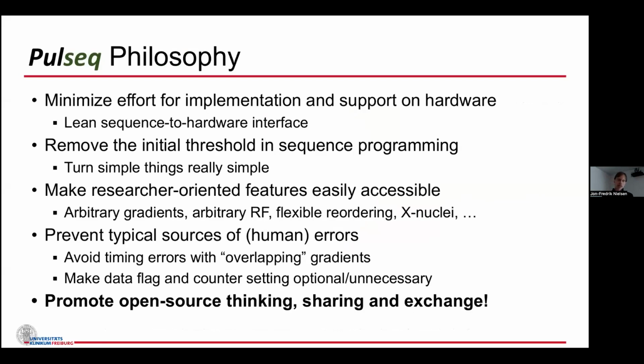Yeah, so the philosophy is to minimize effort to implement, enable easy prototyping, and make things like arbitrary gradients and arbitrary RF easily accessible to researchers.